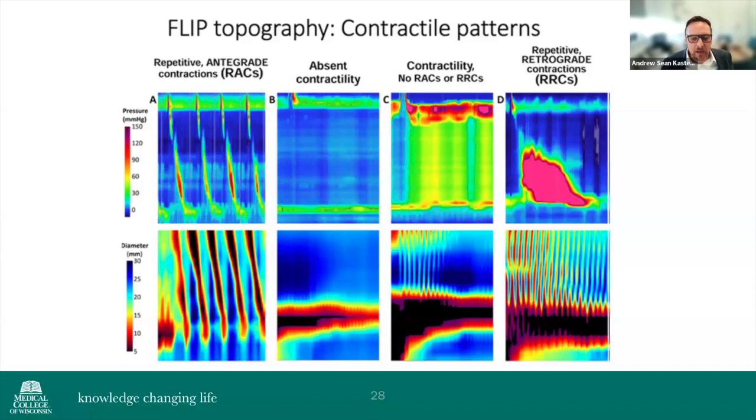You're measuring a distension-induced secondary contraction, which is very different from a voluntary esophageal primary contraction wave. They don't always look the same because you're measuring something different. But in this particular slide, it happens to show representations that fall into a similar category.